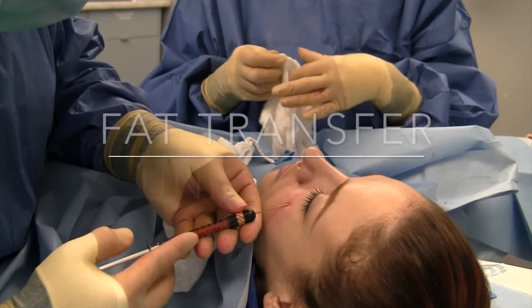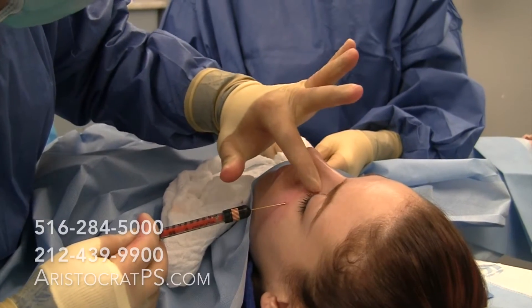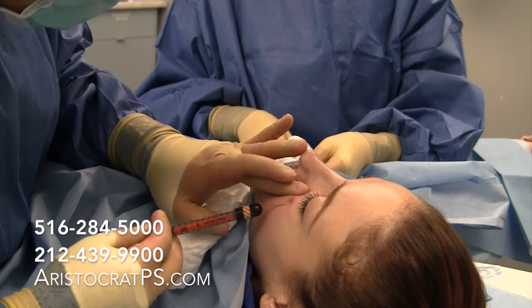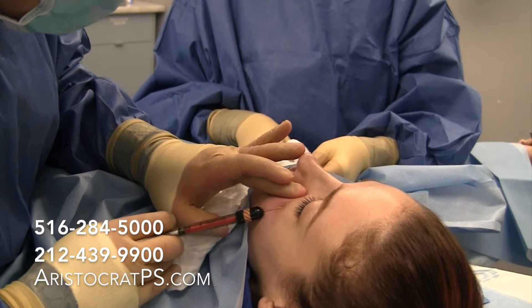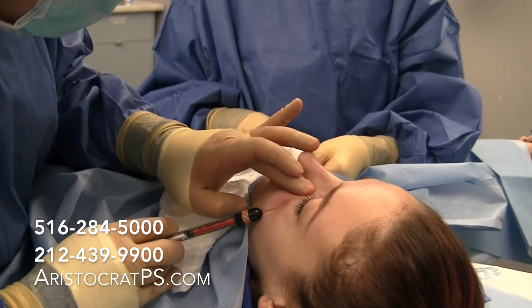So what we're doing now is we've removed some of her fat, centrifuged it to purify it, and she needs a tiny little amount right here in her tear trough. I'm going to put a little bit of fat there to just make that tear trough not be apparent anymore.